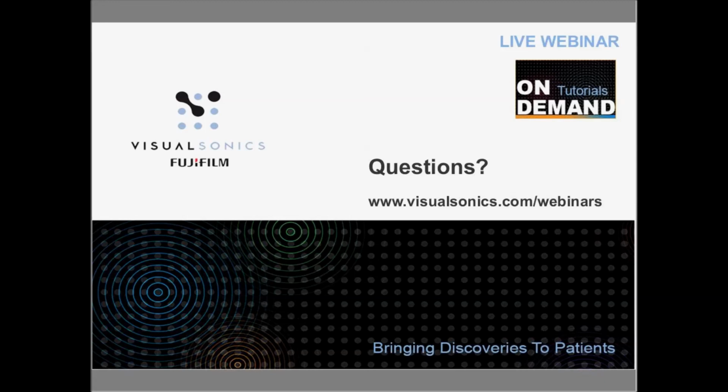Yeah, in any kind of ultrasound imaging, preclinical or clinical, your ultrasound gel is your best friend and can sometimes be your worst enemy. Too much gel standoff, so too much gel between the face of the transducer and the subject animal, can lead to a couple of different things. It can lead to some weird artifacts in the images, like that reverb artifact that I showed, grating lobes, some of these weird sort of angular slash things that come in from the side. Air bubbles in gel are image quality killers.